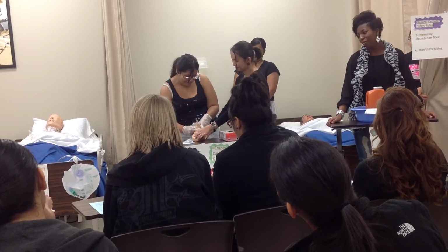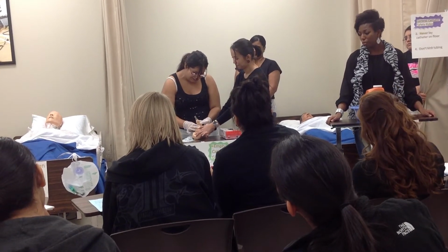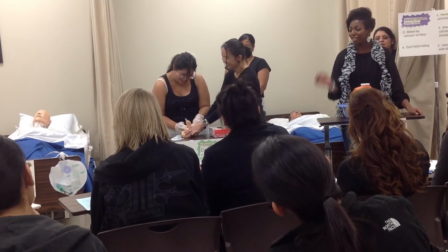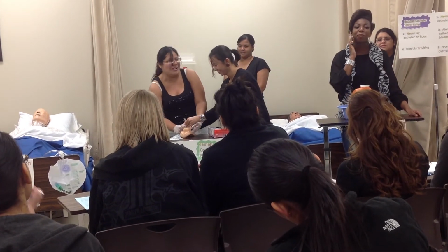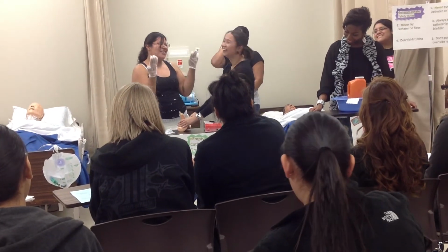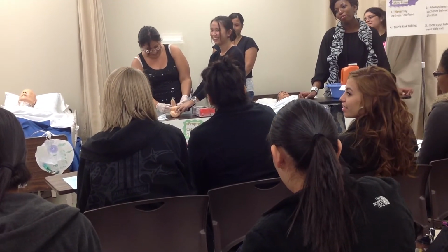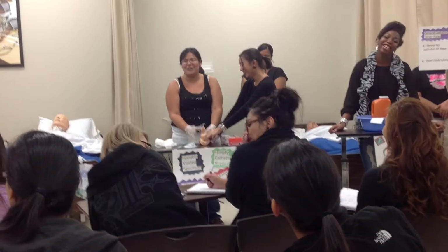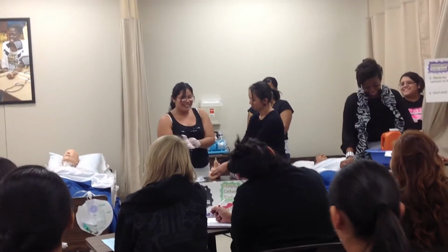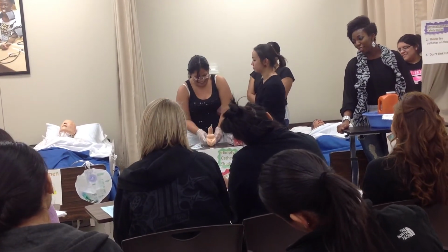And this is really sticky. You can see that it doesn't work well when your gloves get stuck to it too. You're just going to roll that on there if it wants to cooperate with you. You can do it with gloves, and you can have your friend grab hold of it for you and just hold on to it.